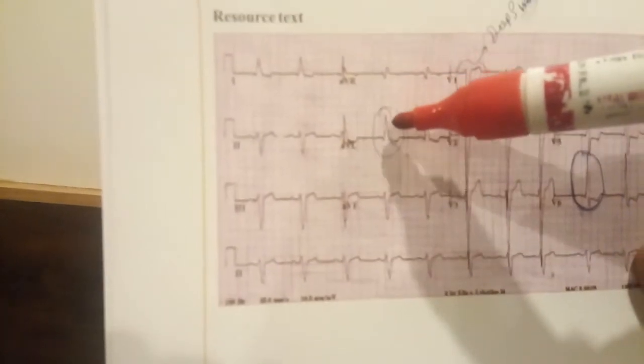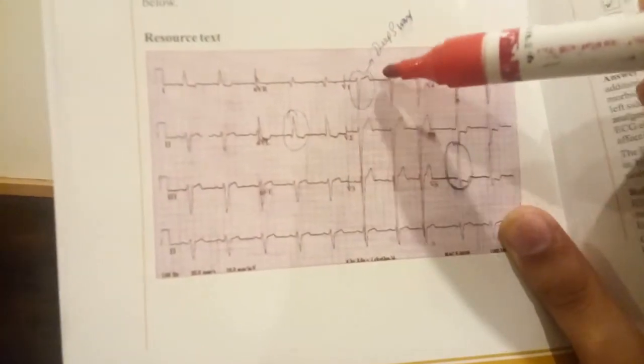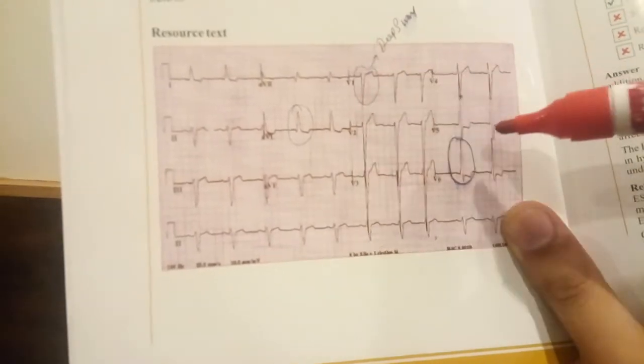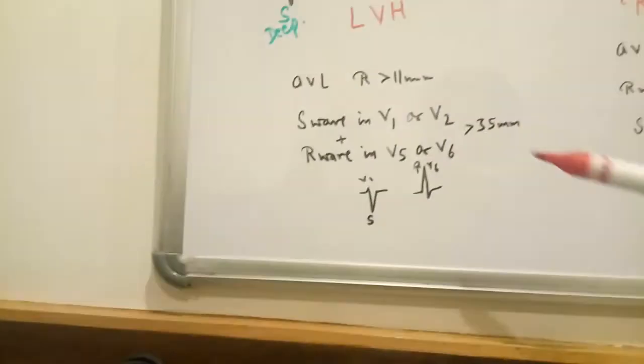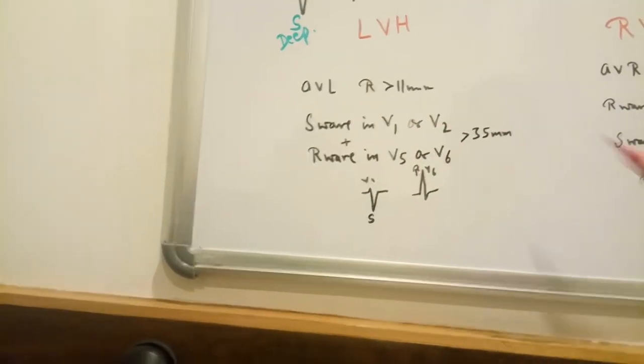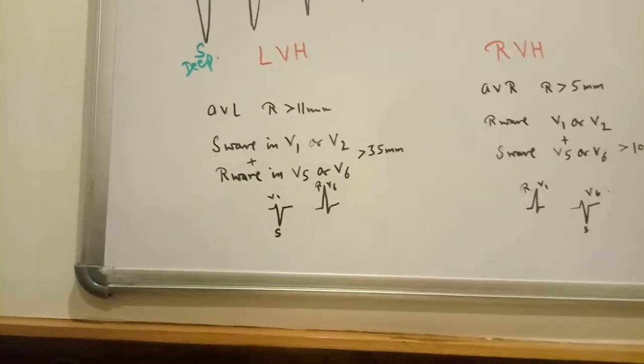AVL, see till here, small boxes more than 11. It is AVL. And in case of V1 it is nearly 16. It is nearly 20. So 20 plus 16 is 36, more than 35. V1 plus V6 or we can check V2 plus V5. So this shows the left ventricle hypertrophy. My dear friends on ECG.